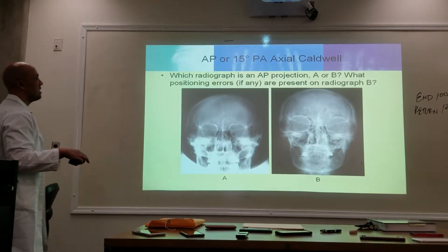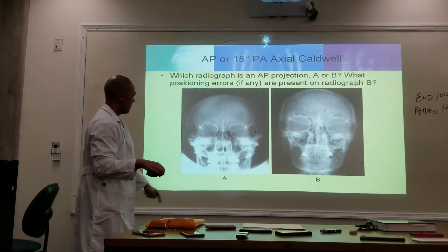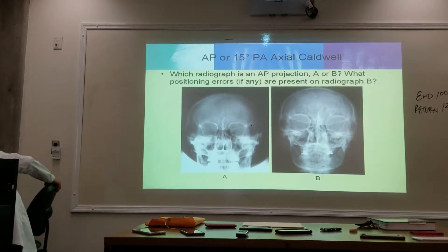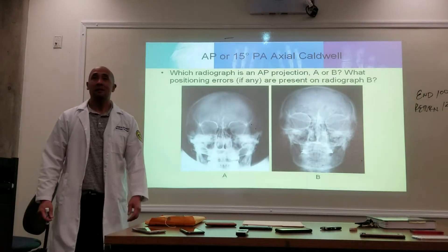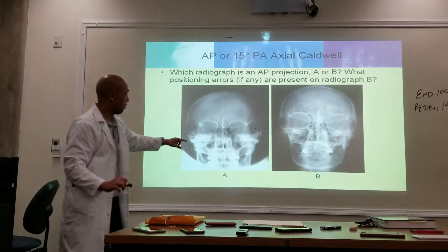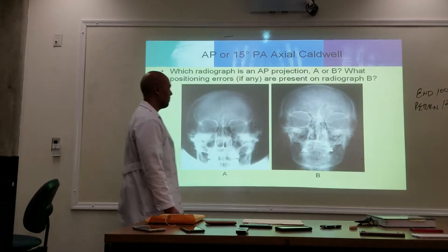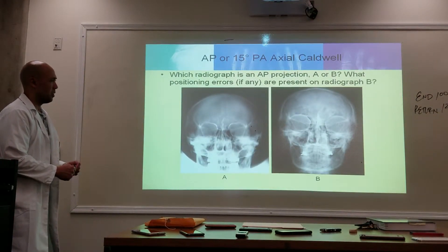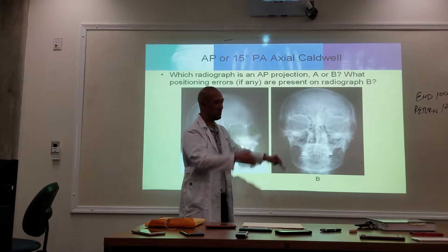AP or 15 degrees PA. Which position is this? It's Caldwell, 15 degrees. How do we know it's Caldwell? The petrous ridges are going to fill the lower third of the orbits. Now, at 30 degrees — is that filling the lower thirds? Or is it below the orbits? It's below the orbits. So this may be a steeper angle of approximately 30 degrees, which would push those ridges down.